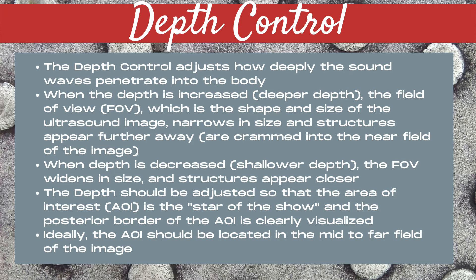Ideally, the area of interest should be located in the mid to the far field of the image, and the posterior border of the area of interest should be easily visualized.